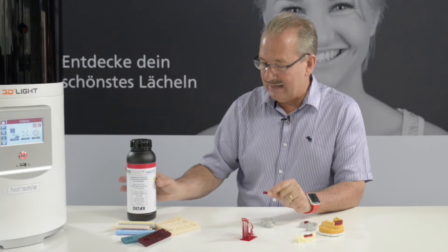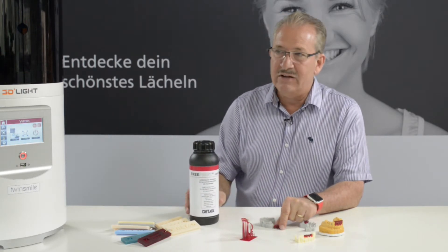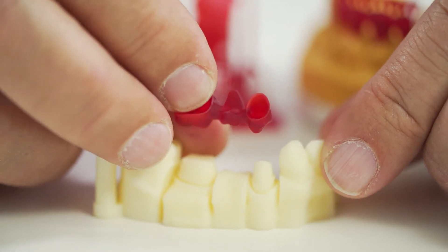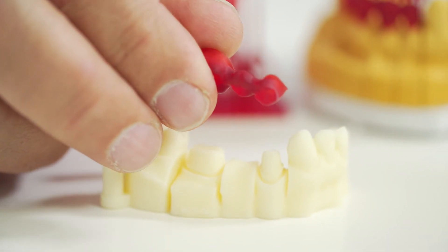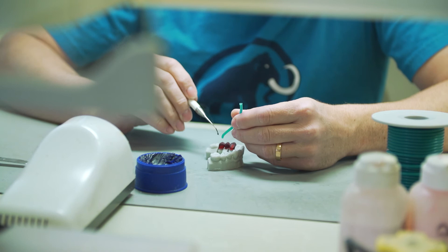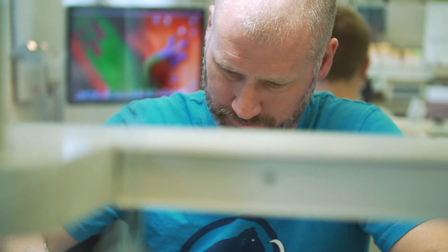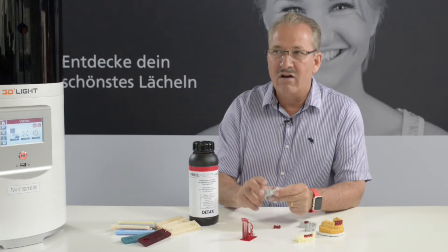The advantage of a liquid like this is that you have a material that is very form stable — there is no distortion. The details on the surface are very good, and it burns out in the furnace with no residues. So you really get very clean castings. For pressing, you can produce parts which are absolutely accurate.